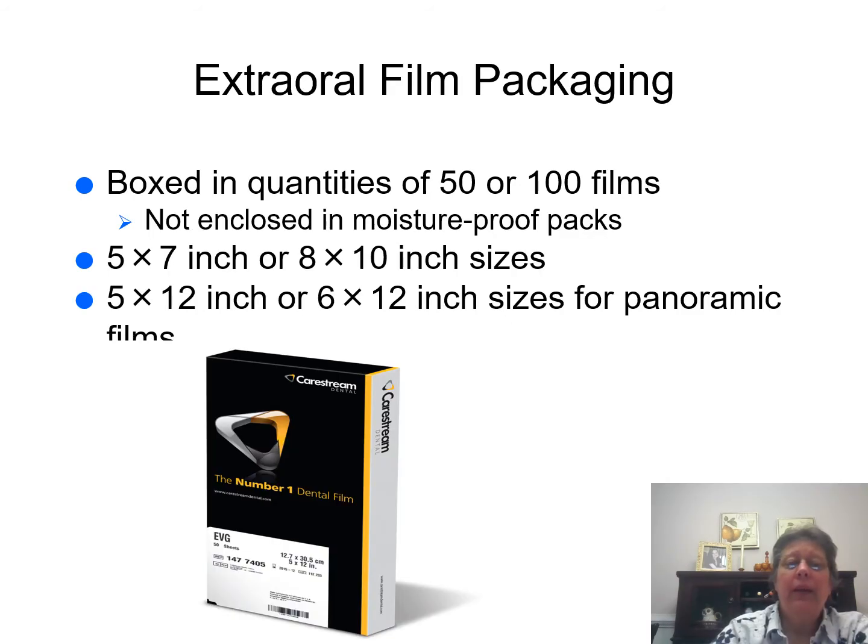Let's talk a little bit about the extraoral film packaging. This is for our panoramic film. It comes in boxes of 50 or 100. They are actually single films inside of the box. They are not covered with the white vinyl outer covering. They don't have a lead foil. They don't have a black paper wrapper. So they come in different sizes depending on which type of machine the dentist has purchased.